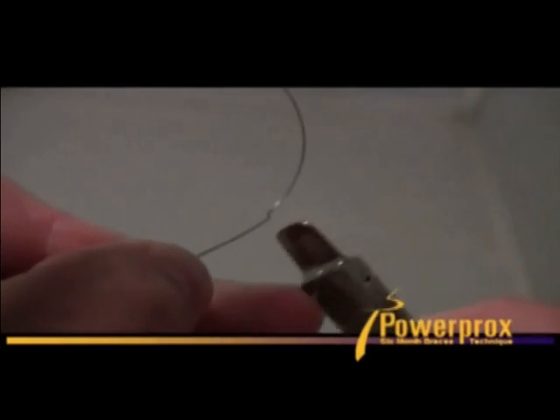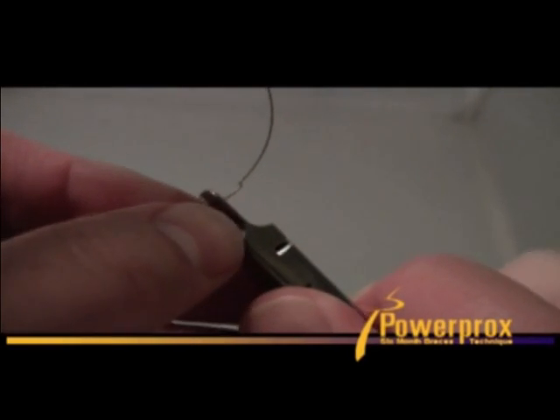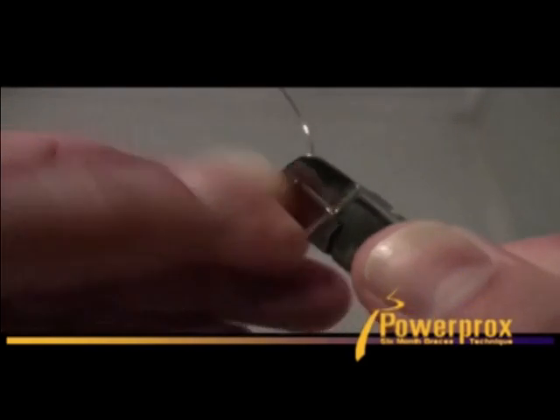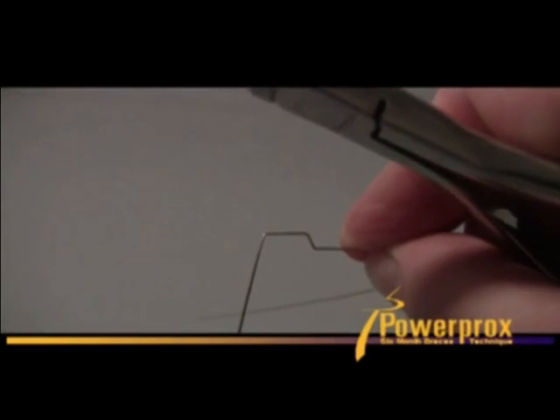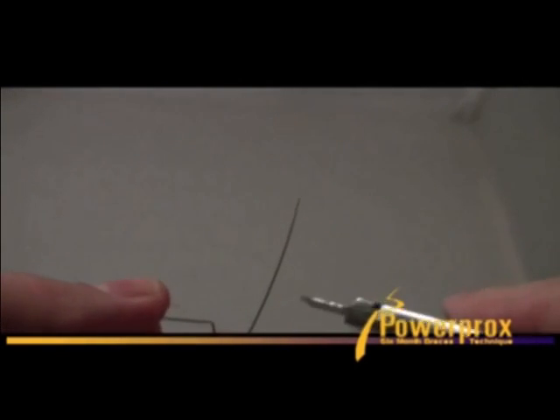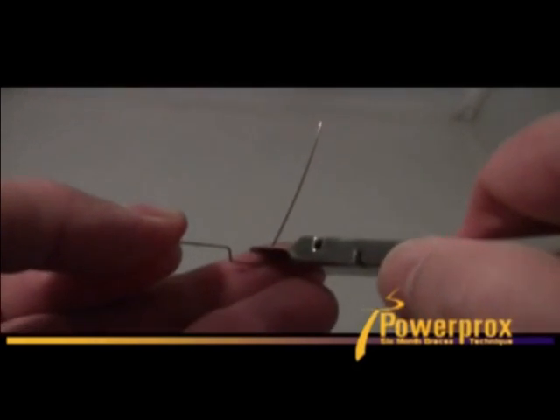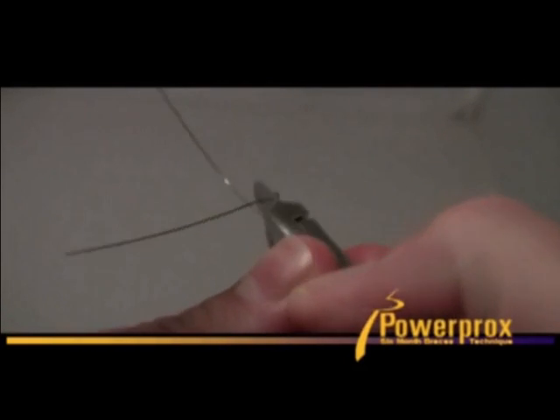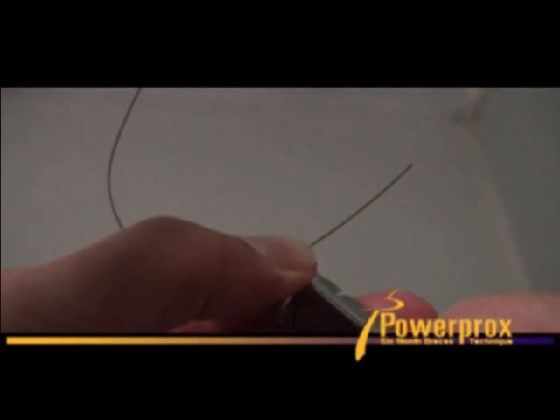Okay, so you have a nice step up, big step bend. Just a handful of millimeters, whatever you need it to be. Then you only need enough space for the canine. It's got to fit between, obviously, the lateral and the first bicuspid bracket, so it has to be shorter than that inner bracket distance. Make your next bend. Then one last bend to make sure now you have your nice big step bend placed.